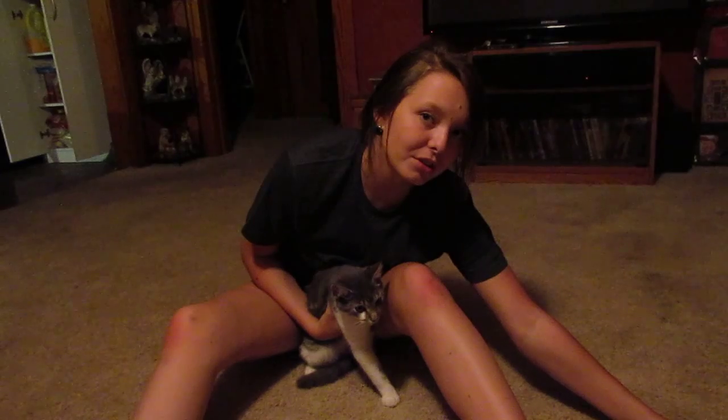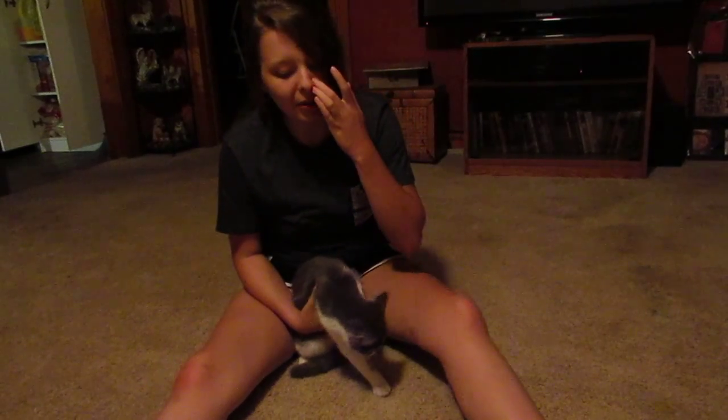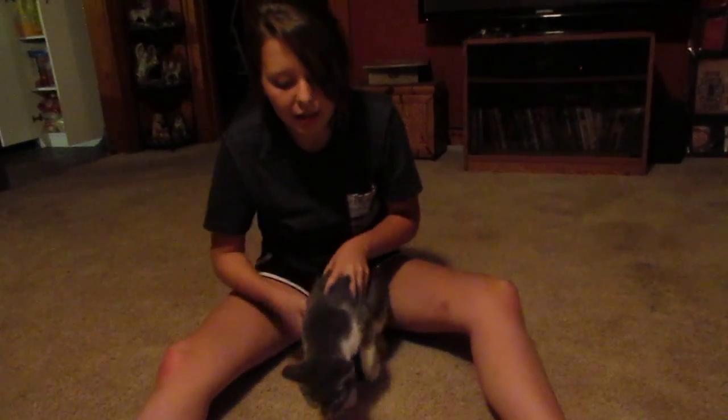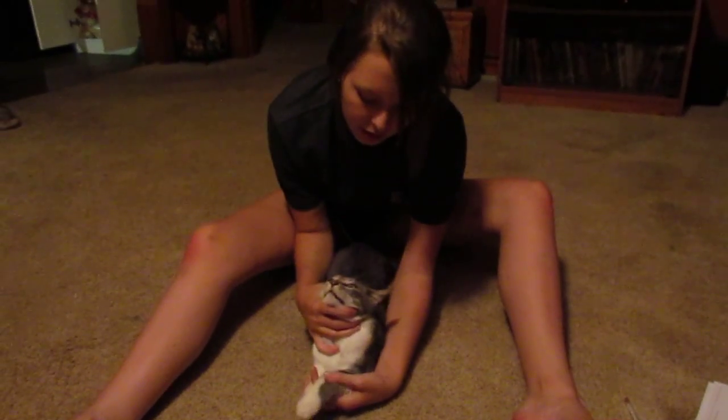This is restraint of the cat for cephalic IV catheter placement. You're going to place the cat in sternal recumbency, which is just this.